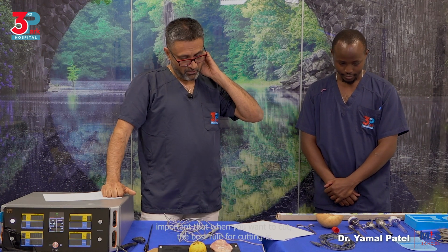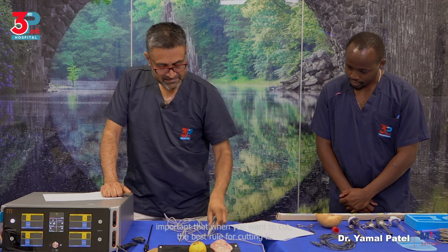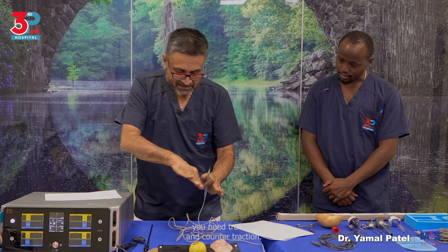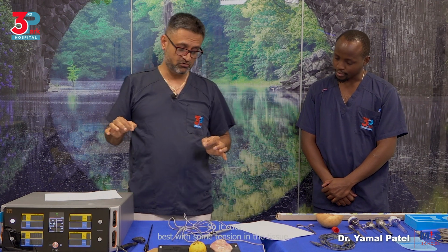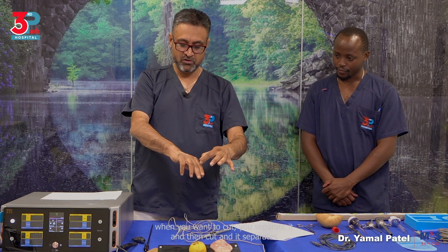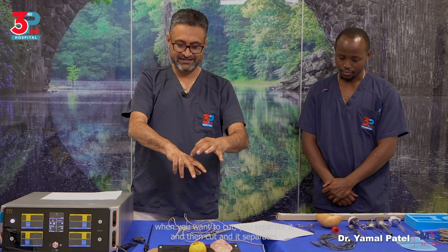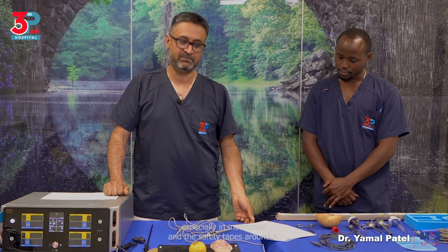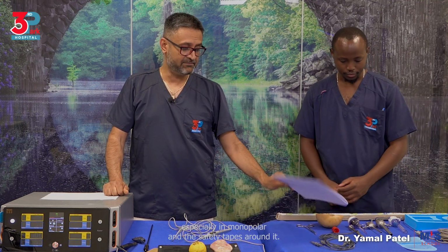Finally, it's important that when you want to cut, the best rule for cutting is you need traction and counter traction. So it cuts best with some tension in the tissue. And it coagulates best when there is no tension in the tissue. So you try and coagulate when the tissues are together, and when you want to cut, you separate them and then cut, and it separates very nicely. So these are rules of use of electrosurgery, especially monopolar, and the safety tips around it.